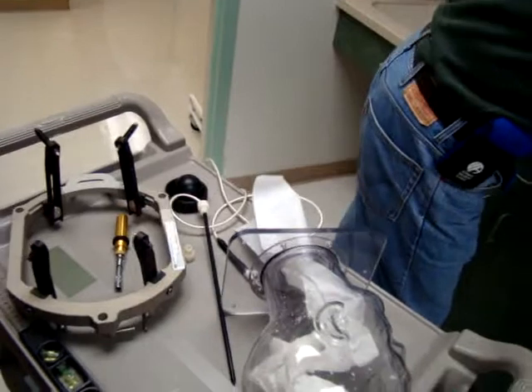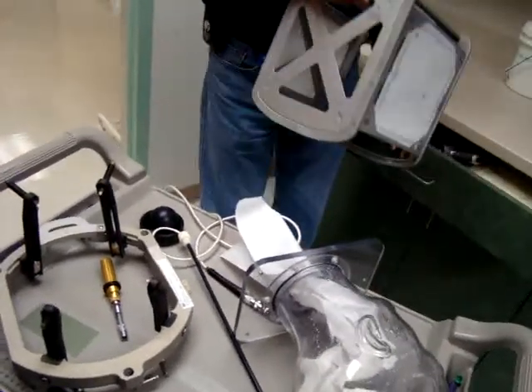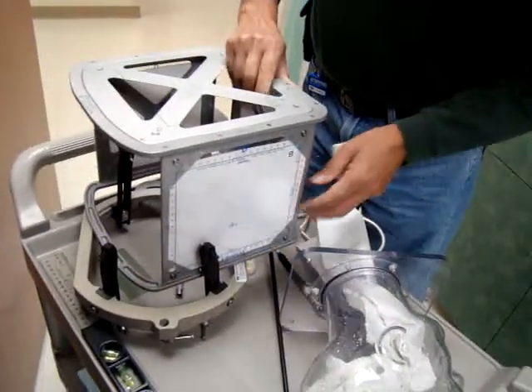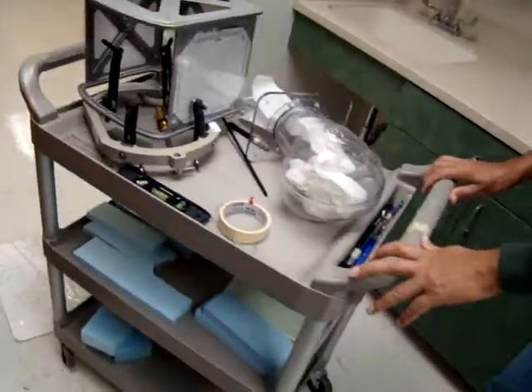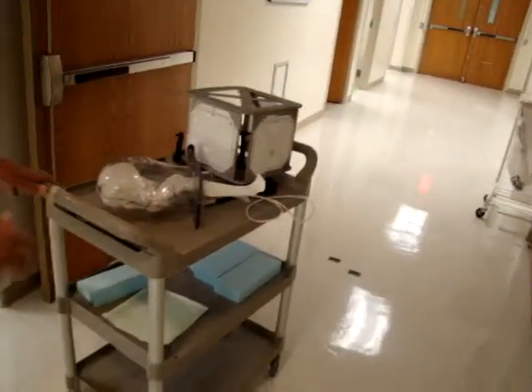So all these things we just did — this was the basic work of a medical physicist. After that the patient comes and they just treat them. Let's move it to our store.